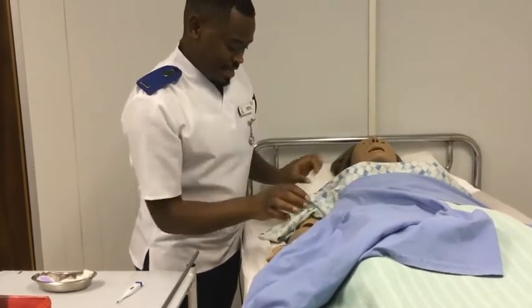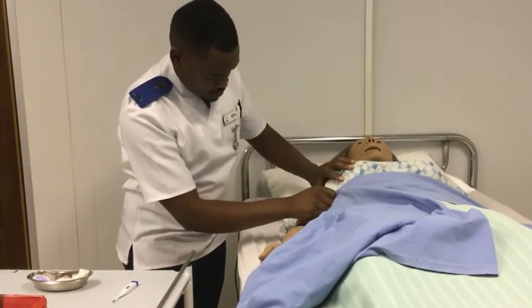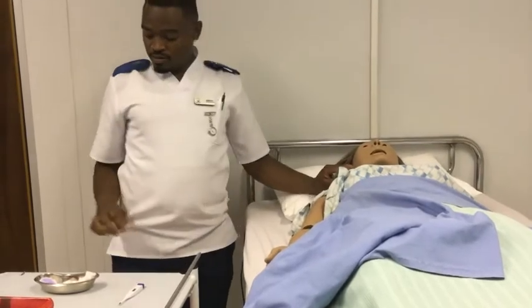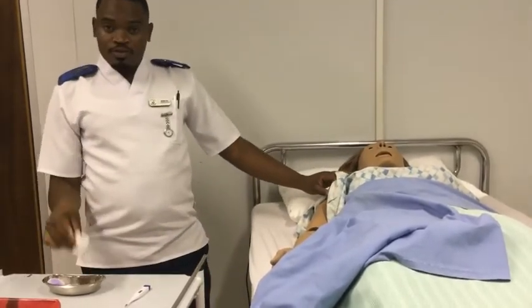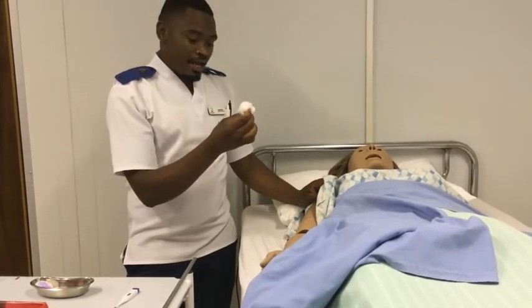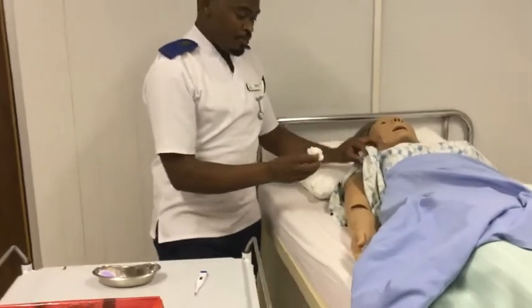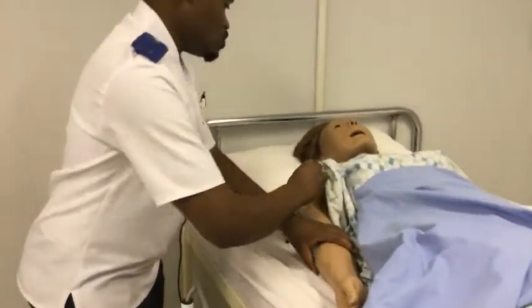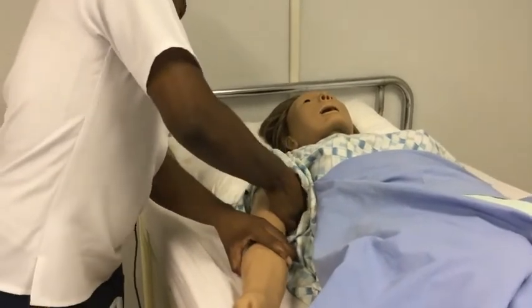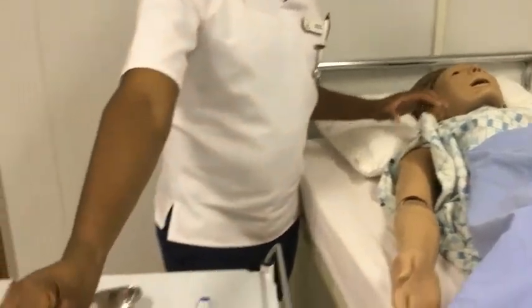Okay. And Mesusi, can I see your armpit? Thank you. So with the dry swab, we are going to try to clean the armpit, starting from the anterior to the posterior, to make our patient's armpit dry. Alright. And then we discard.